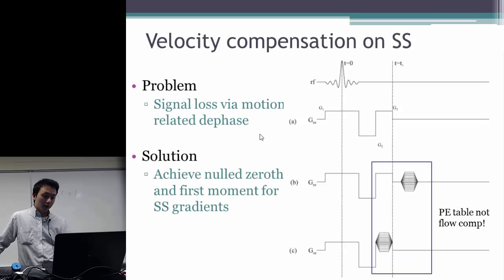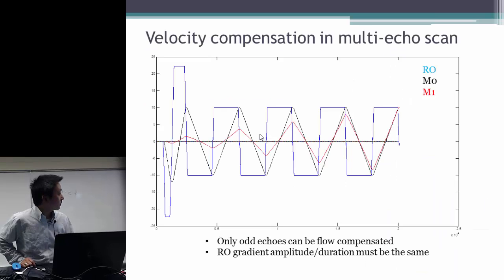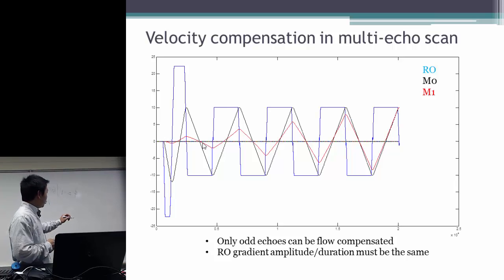Okay, so I couldn't understand why the odd and even echoes are not the same. Why is the behavior for odd and even echoes not the same? For odd echoes we have compensation at each location, right? But for the even ones, what's the reason for it?